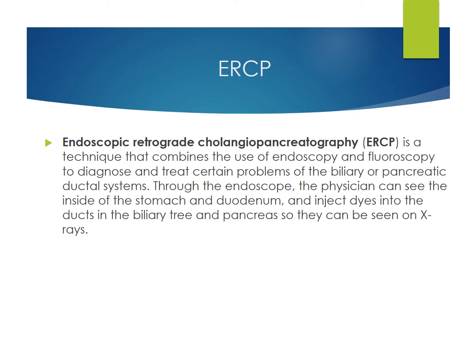ERCP, endoscopic retrograde cholangiopancreatography, is a technique that combines the use of endoscopic and fluoroscopic to diagnose and treat certain problems of the biliary and pancreatic duct systems. Through the endoscope, a physician can see the inside of the stomach and duodenum and inject dyes into the ducts of the biliary tree and pancreas so they can be seen on X-rays.